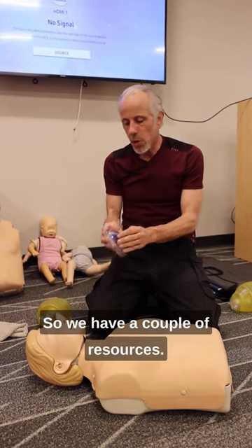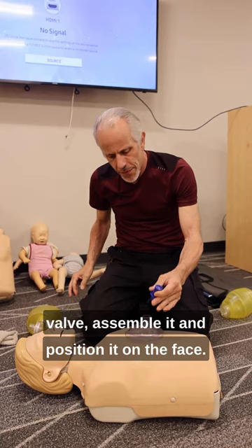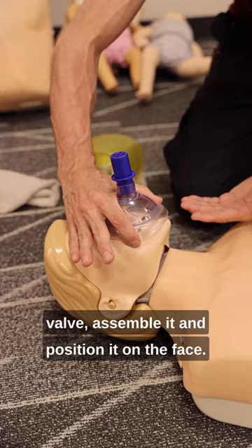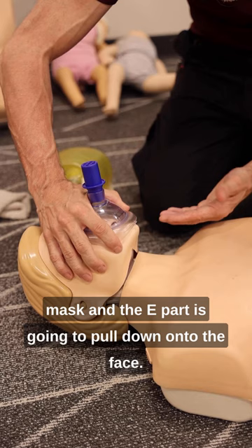We have a couple of resources: a pocket mask and a blue one-way valve. You would have the student remove the blue one-way valve, assemble it, and position it on the face, so the C part of the hand goes to the top of the mask and the E part is going to pull down onto the face.